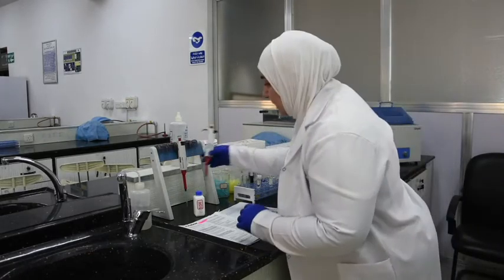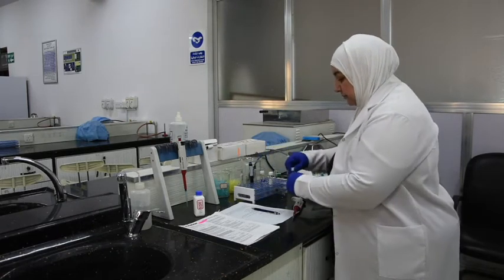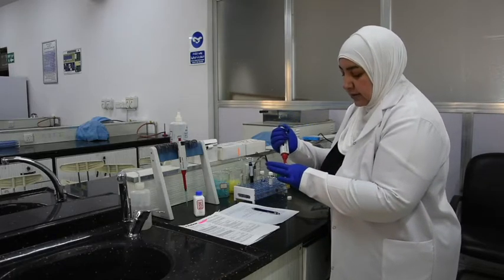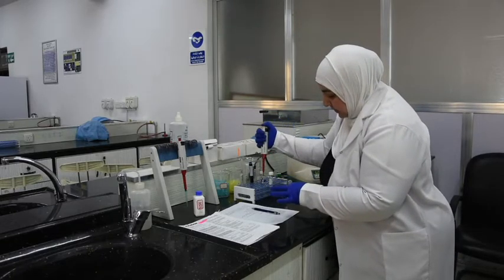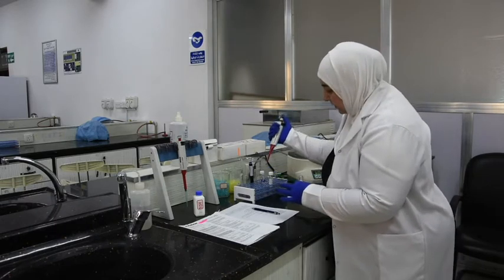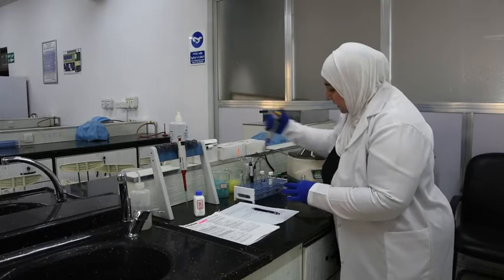We take this micropipette and the serum. We need 200 microliter of serum. My micropipette is 100, so I need to draw 2 times to have 200 microliter of serum.